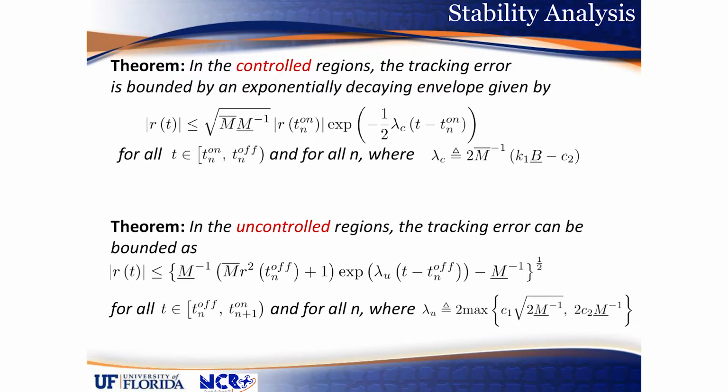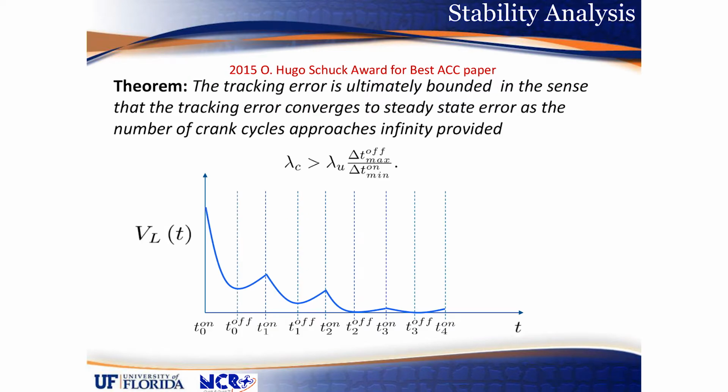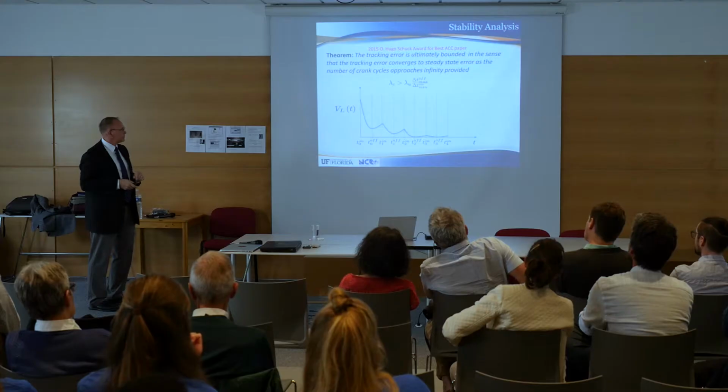This is just some of the mathematics that say that when we can stimulate, we can get exponentially decaying results, but there can be instabilities when we're not stimulating the muscle. And so remember in the very beginning I said that we want a positive function that decays, but when we're not stimulating the muscle, there are periods when we have growth. And we have to monitor that very carefully, because during those periods of growth, it can actually cause unpredictable behavior or instabilities. And so because of that problem, we have these timing conditions that come out of our analysis, and the timing conditions also tell us when we should switch between different muscle groups.